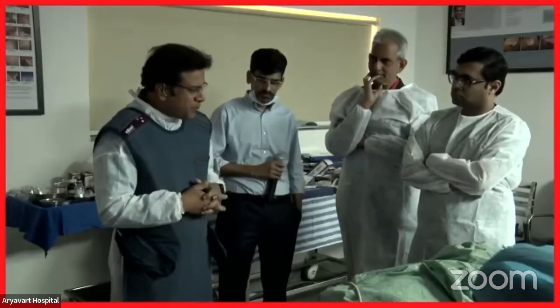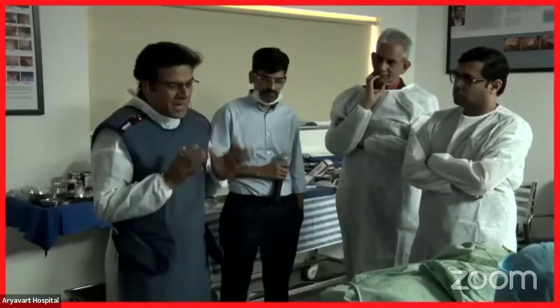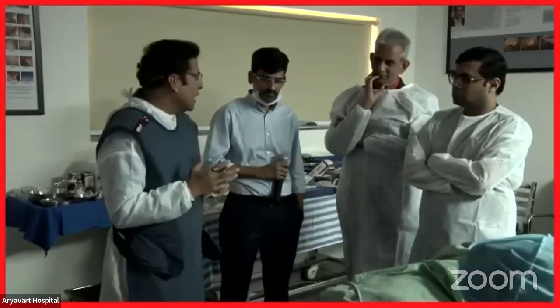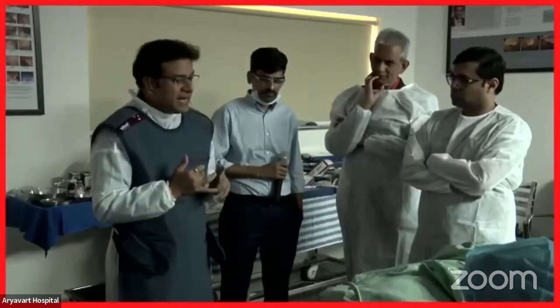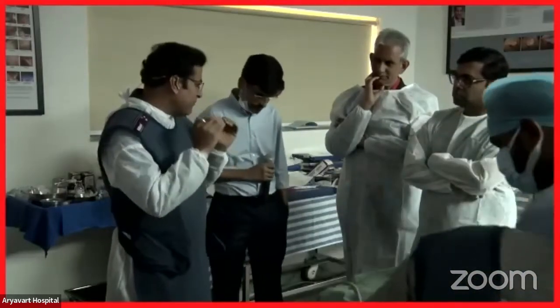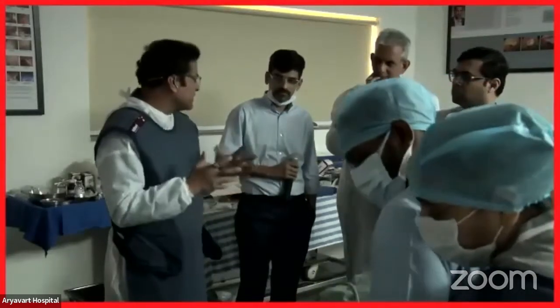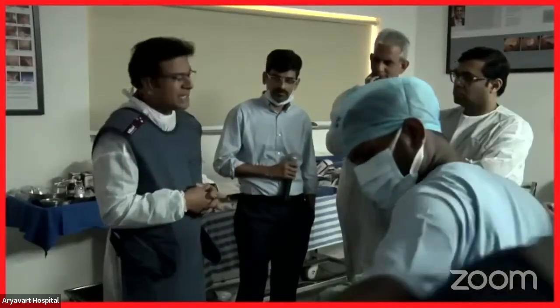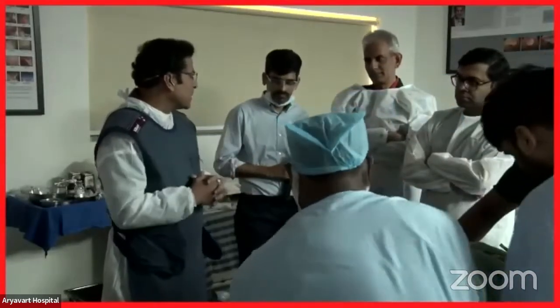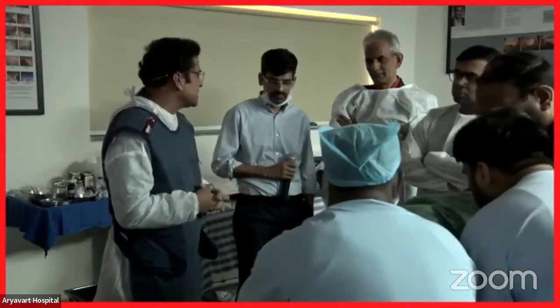But since we don't have this balloon, what I would suggest is applying some simple logic. I think you will rarely puncture a colon. And second, reduce the procedure time, instill fluid only when you are ready to puncture, and give Buscopan, which decreases peristalsis to some extent and helps you significantly. Because we don't have this balloon, we have still done approximately 25-30 cases, all without a balloon.